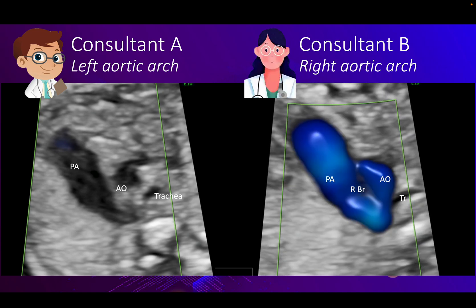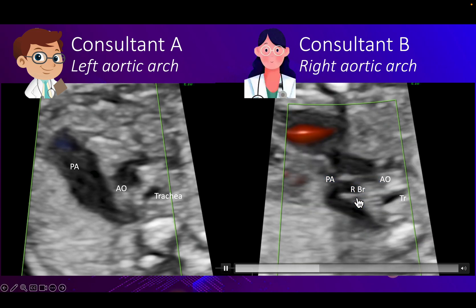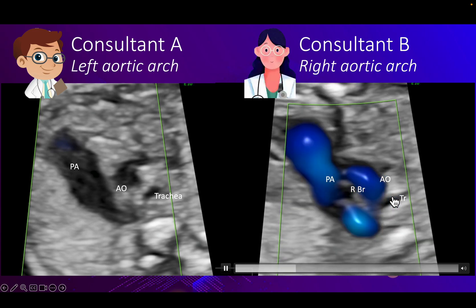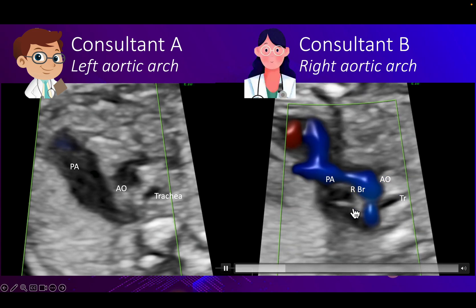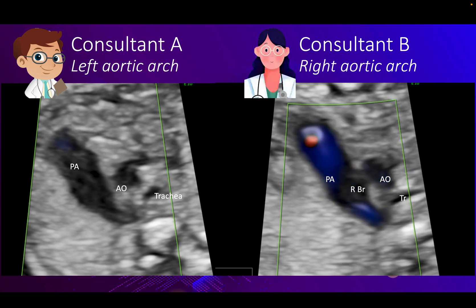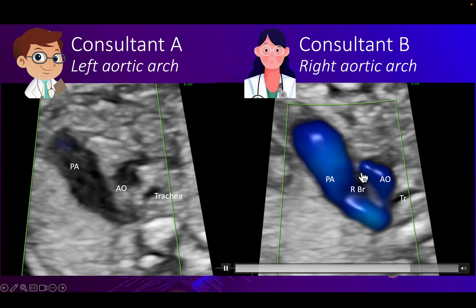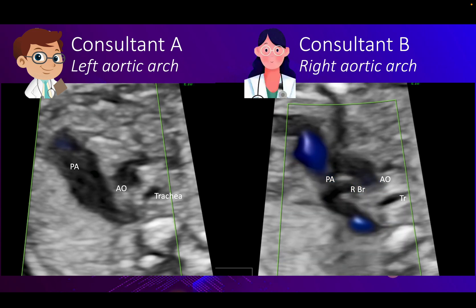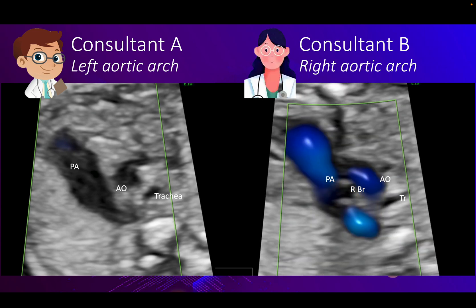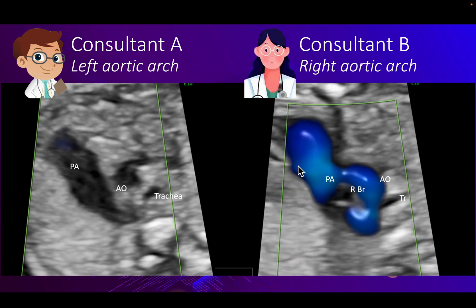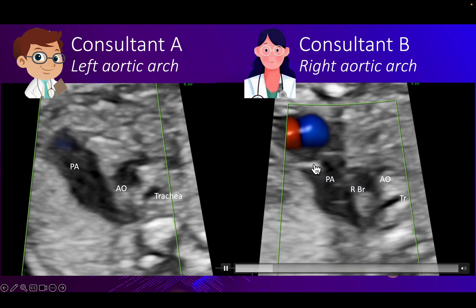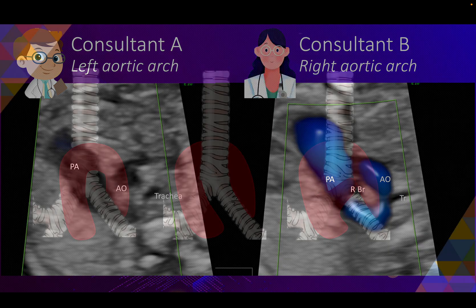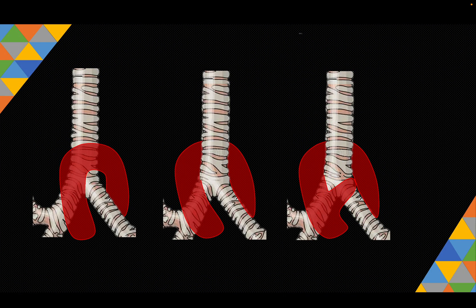What appears is not the trachea — it's the right bronchus, and the aorta is coming on the side of the right bronchus. This is the trachea. We normally don't see this kind of pattern on a three-vessel trachea view. What is happening here is that this view is slightly lower than the three-vessel trachea view, and it's an angled view where the aorta is crossing under the pulmonary artery from right to left and back, giving the confusion of a right-sided aortic arch.